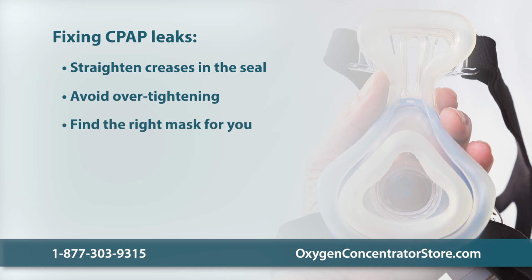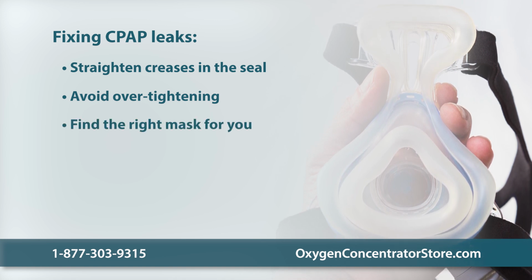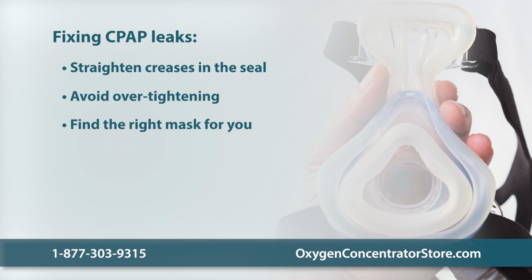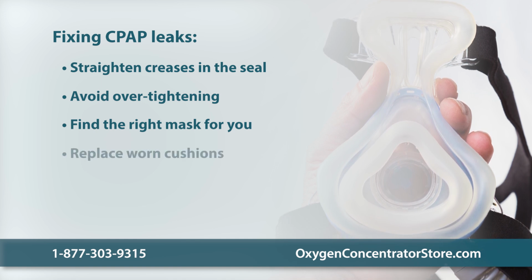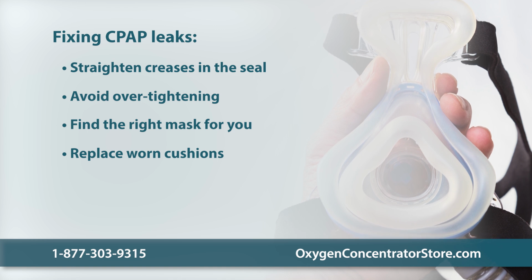Not every mask works for every patient. Try a couple of different masks before purchasing and consider a high-quality mask that won't bend in the seal. Replace worn cushions regularly, as silicone softens and loses shape over time.